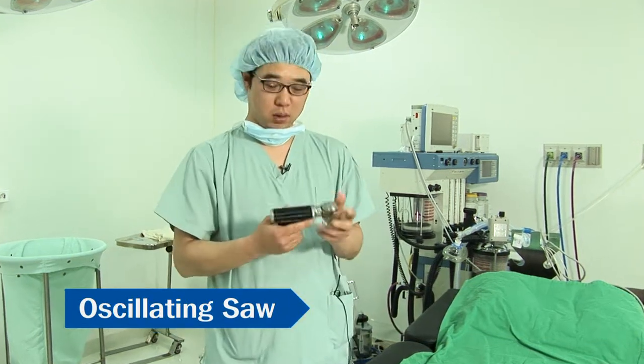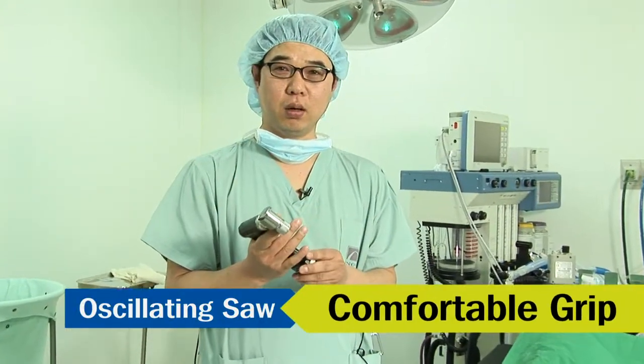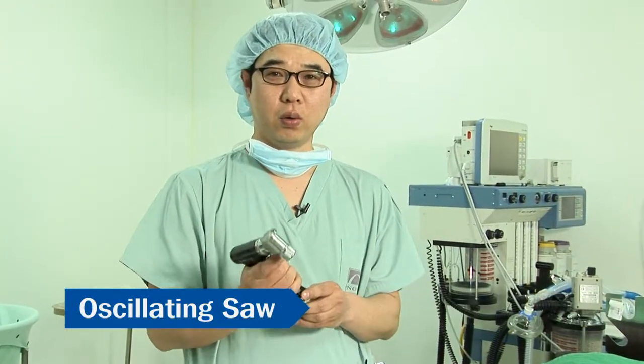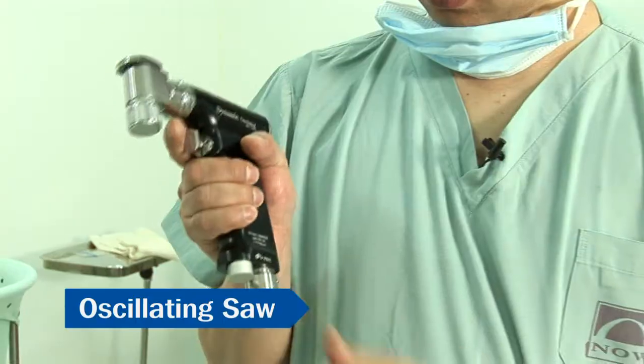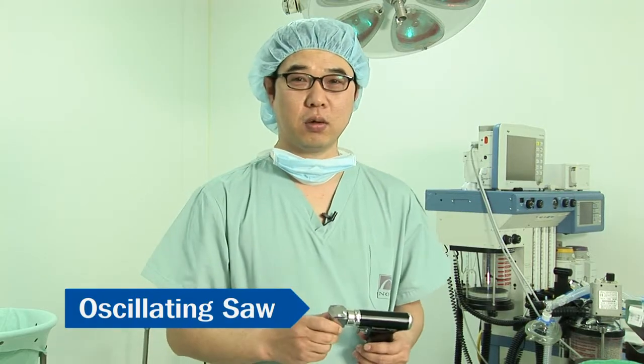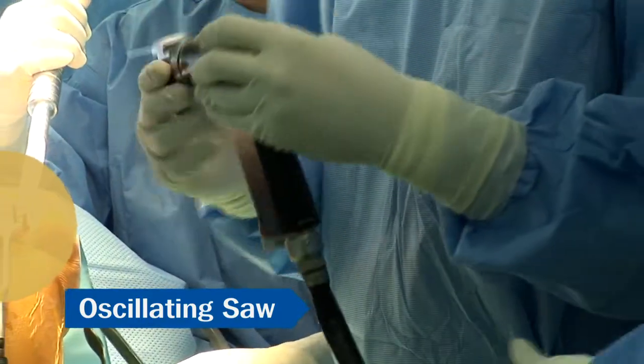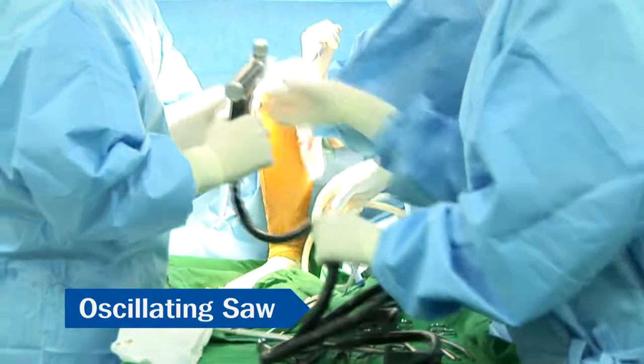It has a nice firm grip so whether you have big or small hands, you won't have any difficulty using this product. There is no inconvenience with the trigger either. What I like best of all is the power transmission when I use the blade. When cutting bone, I could feel a sufficient amount of power being transmitted.